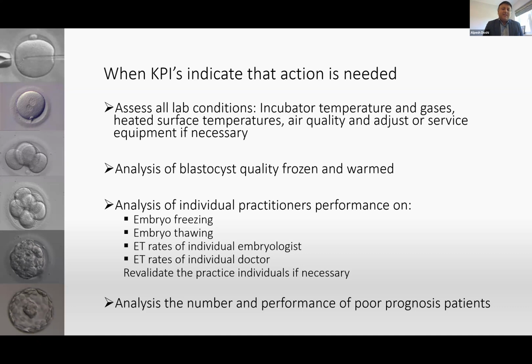Because quality assurance is a huge part of what we do in the laboratory, we want to make sure that the protocol, the process is standardized so that all your embryologists are doing it the right way, the correct way, and more reproducible way. So it may be a case that your practitioners have a bit of variation in the way they're doing it. Your embryologists need a bit more training. So it's quite important to make sure that there is no practitioner-specific issues here as well.